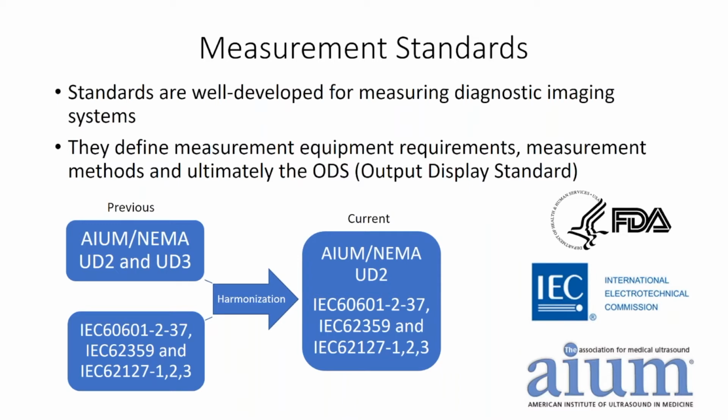Diagnostic ultrasound has been in clinical use for several decades, and over that time has established an excellent safety record. Measurement standards have been in development nearly as long as the technology itself. Standards are well developed for measuring diagnostic imaging systems.